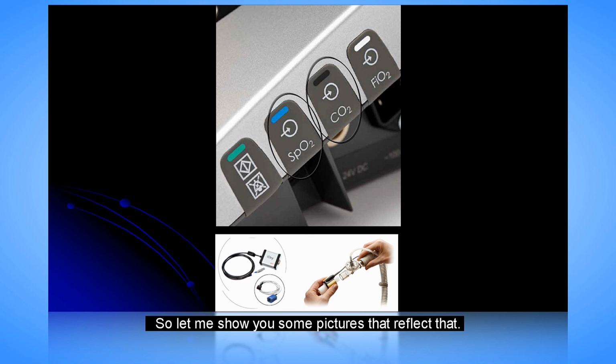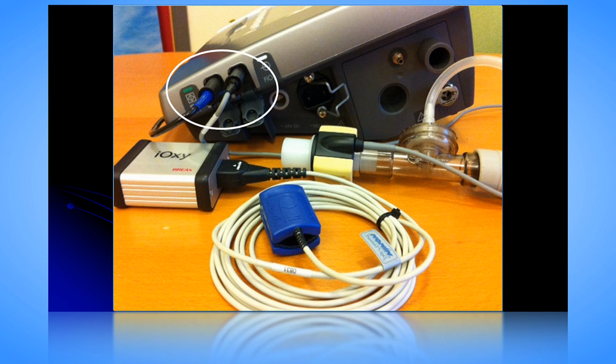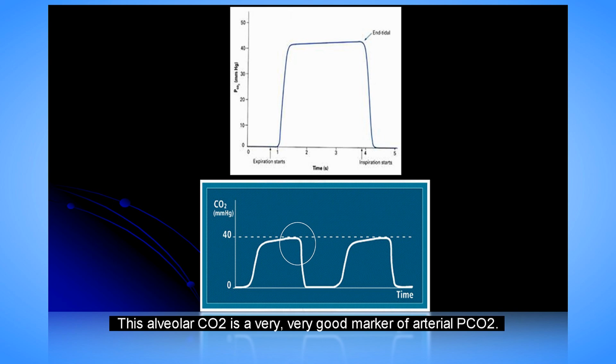So let me show you some pictures that reflect that. This is an example of a device that included two different sensors to evaluate both end-tidal CO2 and oxygen saturation. In this picture, you can see the CO2 expiration curve. This reflects the kinetics of CO2 exhaled during a normal breath. As you can see in the last part of this curve, there is an increase in CO2 that is expression of the CO2 present in the alveoli. This alveolar CO2 is a very good marker of arterial PCO2. We are able to know arterial PCO2 levels.